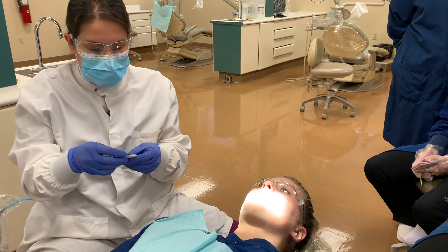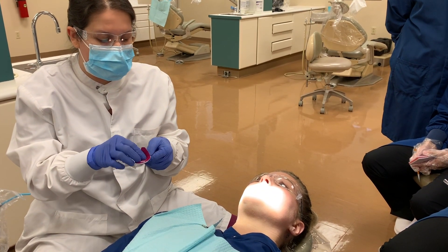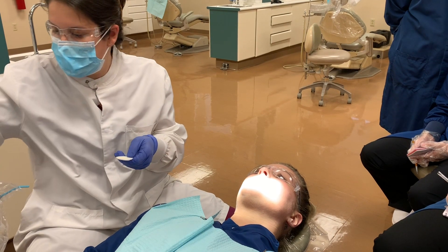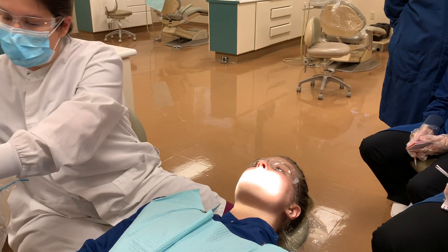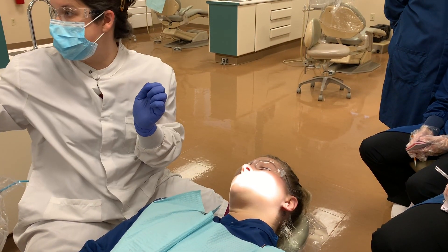The product that we use is 5% sodium fluoride. It comes in this little package. You open it up and use the brush applicator. It bends at the end, so you can bend it to make it easier to apply to the teeth.